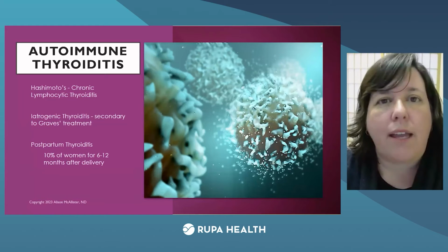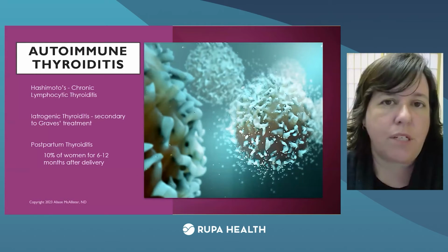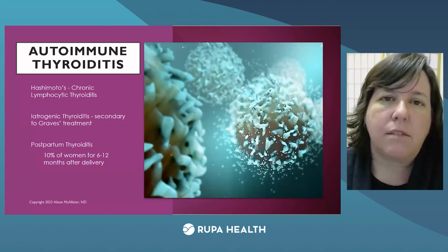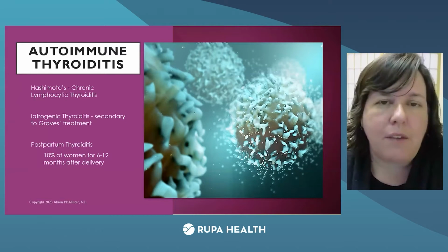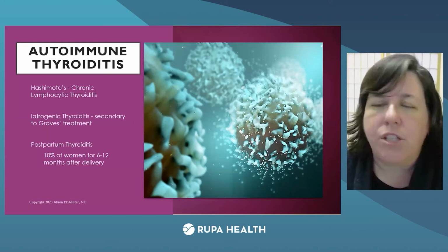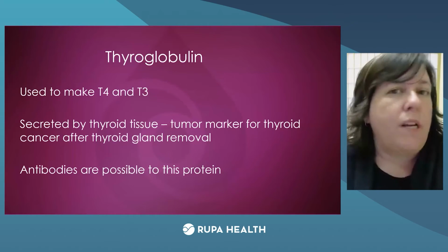People who have high antibodies, even in the presence of normal thyroid function tests, in other words, TSH, T4, T3, are more symptomatic because this is low level inflammation. This is the thyroid not working properly to put together thyroid hormone, even though the labs might look okay. So we'll see these, but a lot of these people are going to fit into the terminology that we have of functional hypothyroidism. And we're going to talk hypothyroid mostly because that's the majority of what you're going to see.